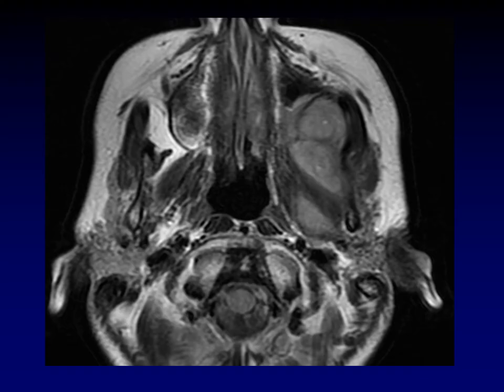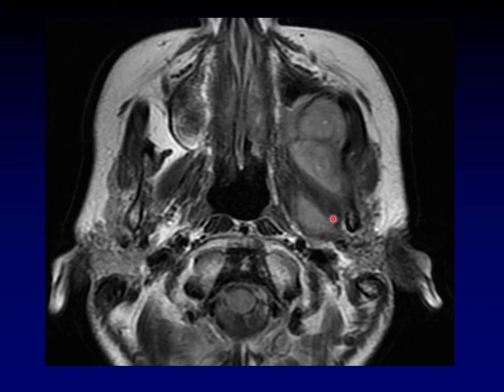The other major category of disease in the masticator space is tumors. For example, this large mass — look how it is pushing that parapharyngeal fat posteriorly and medially. This happens to be a mass that arose from the muscles of mastication. It's a malignant solitary fibrous tumor, which is an unusual histology.